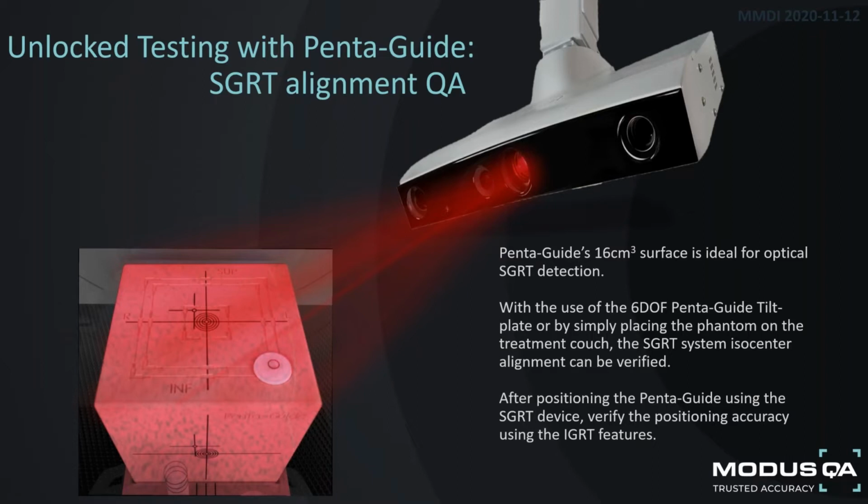And then that alignment accuracy can be verified with the IGRT system by performing a cone beam CT. And then the treatment isocenter can be verified using MV projection images. If you add the use of a tilt plate, you can now alter the rotations of the Penta-Guide and perform the 6 degree of freedom couch adjustments using the SGRT system. So overall, you now have a Phantom that can complete the entire isocenter alignment QA for SGRT, IGRT, as well as the treatment delivery isocenter.